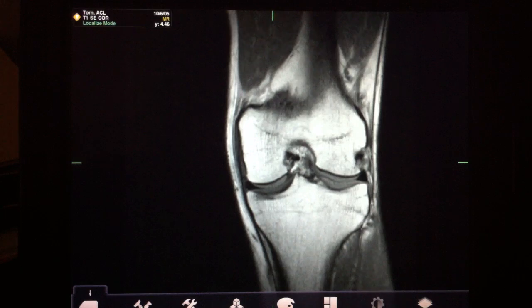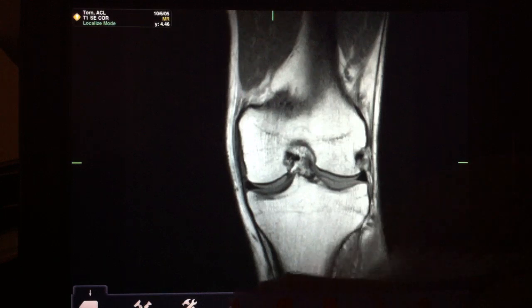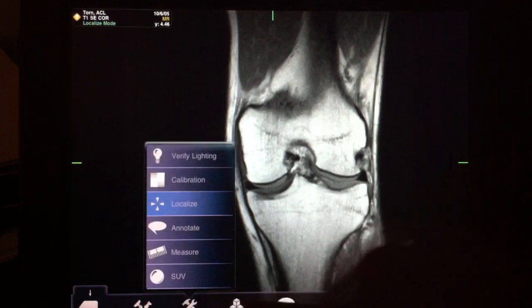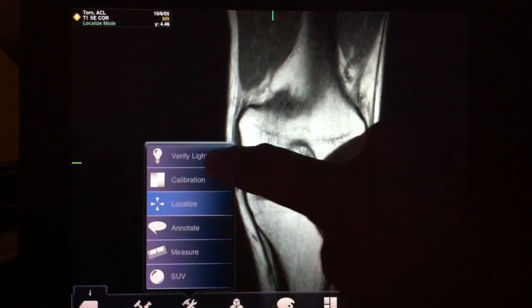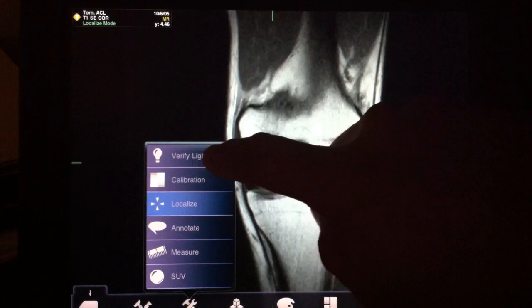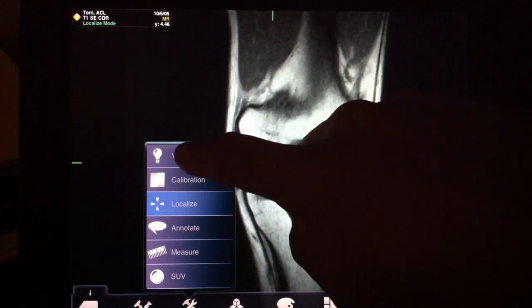There is a calibration setting, which I've turned off, but this is how it works. Normally, when you first log in, it'll send you to this screen.